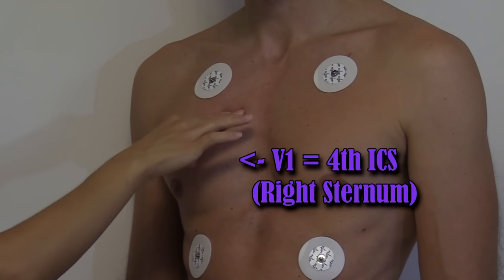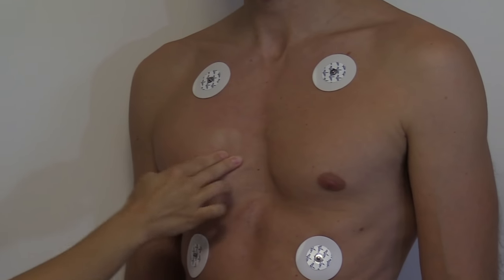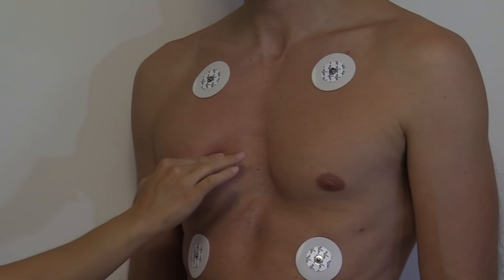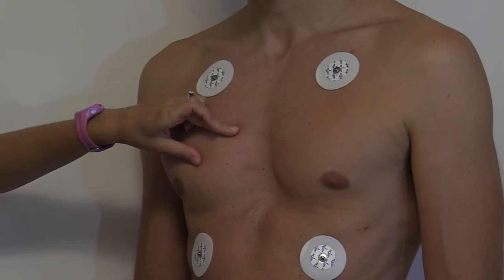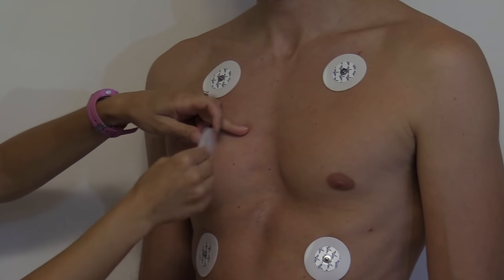V1 is in the fourth intercostal space to the right of the sternum. So we're going to go down — there's the third, there's the fourth. We're in the fourth intercostal space and this is where V1 is going to go, slightly just next to the sternum. We're going to cleanse the area really well, rough it up, and then place the electrode.